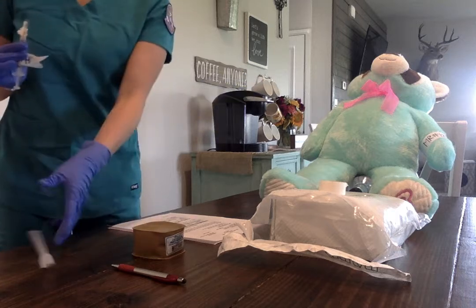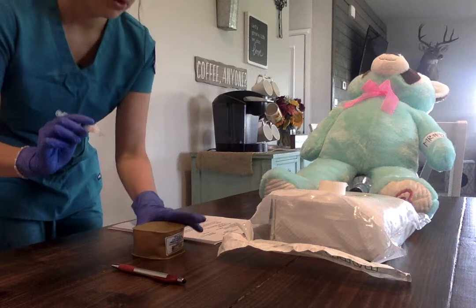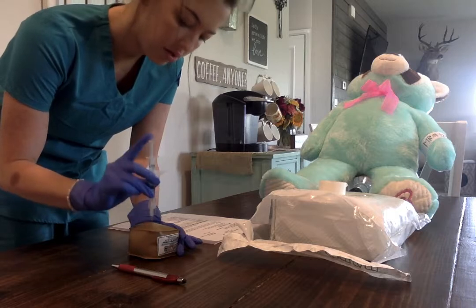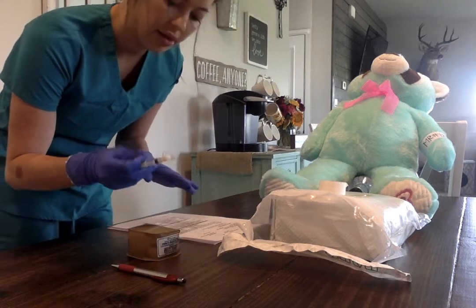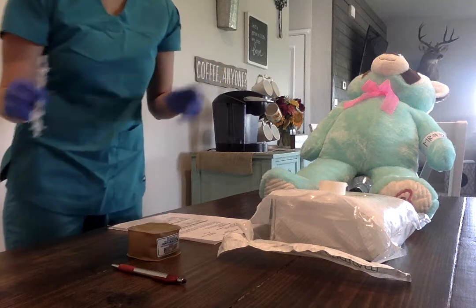It is dry, so I'm going to get rid of the cap. I'm going to Z-track and at a 90-degree angle. Okay, and activating that safety and disposing this into the sharps.